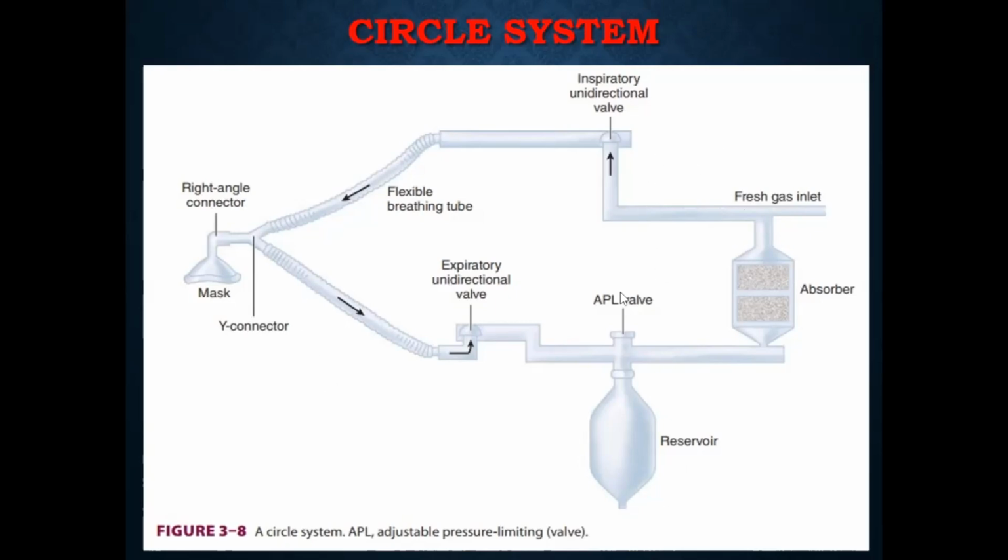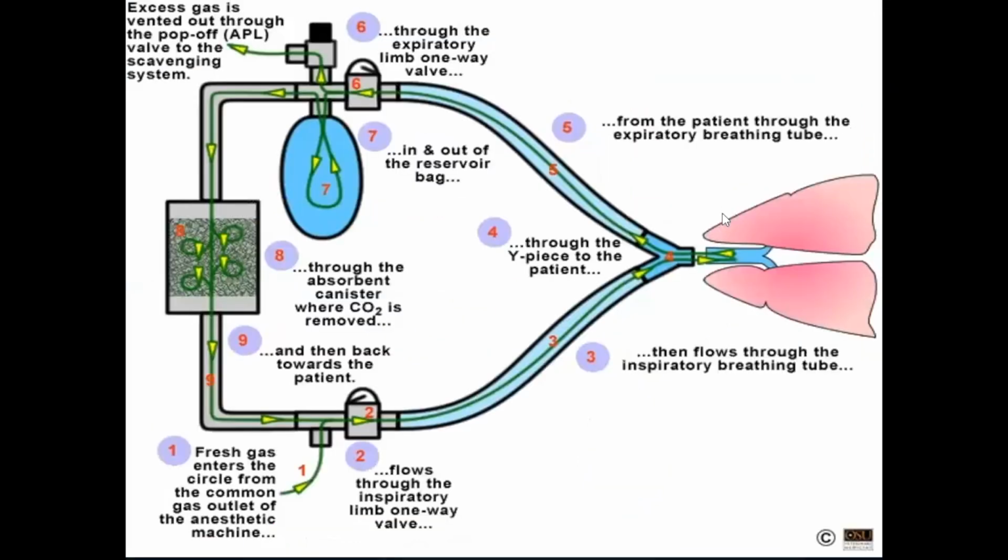How the reservoir and APL valve work depends on whether we are switching on the ventilator. This circuit system is devoid of the ventilator part, which is connected here, so I'm not including it. I'm only talking about the circuit system. How the ventilator controls this, and how we use this when we switch from ventilator to manual, we'll talk about later.